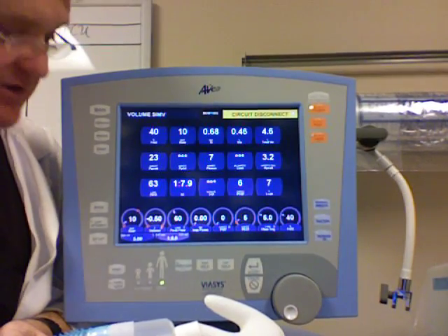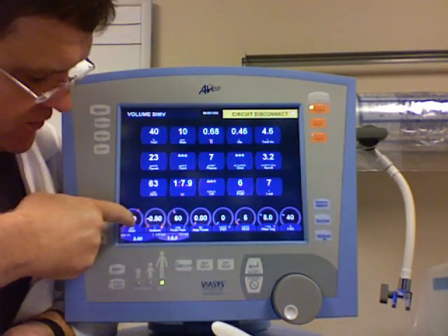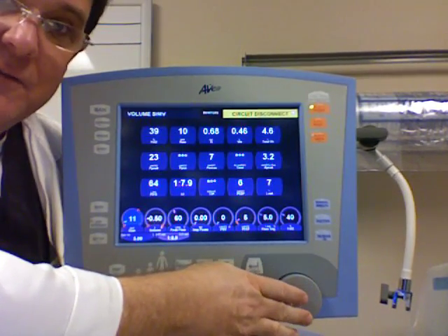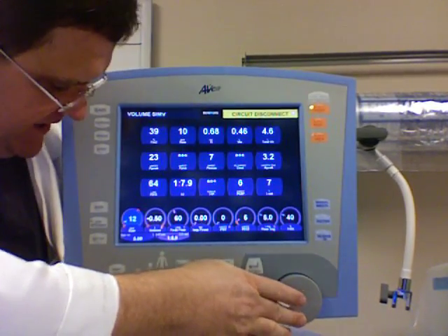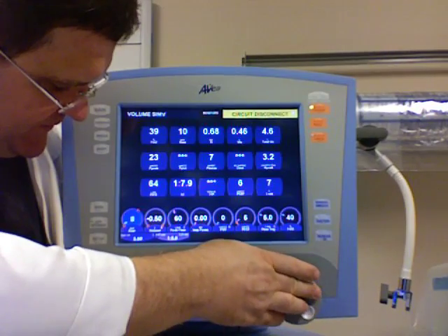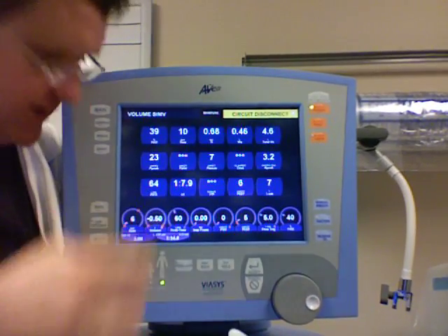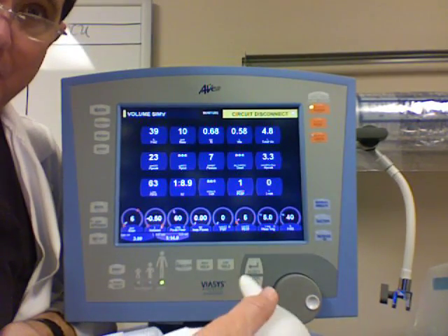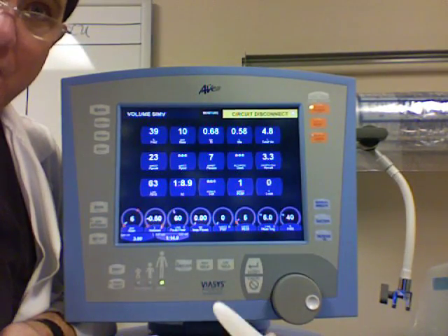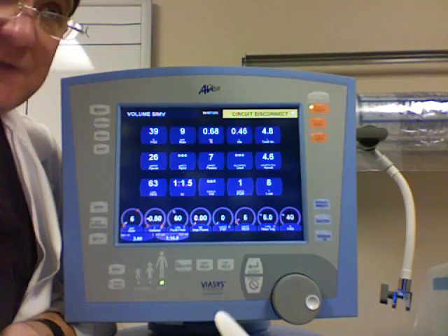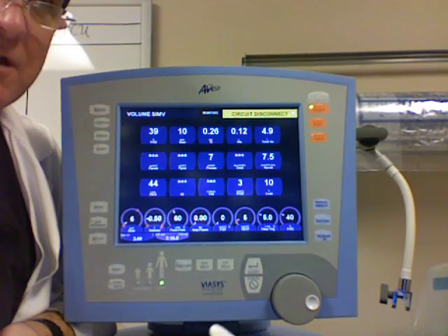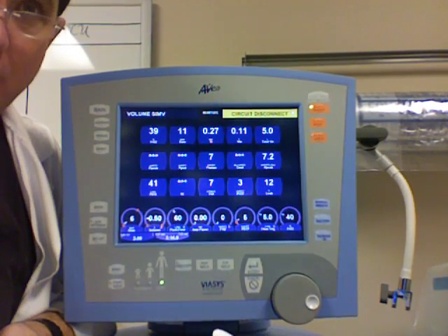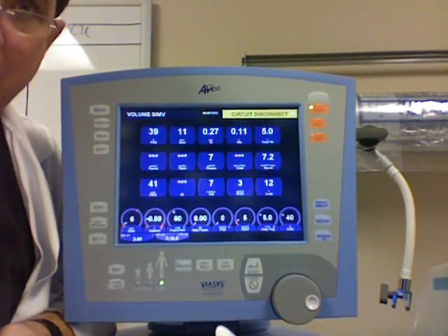But in SIMV you can start turning your rate down — let me turn it down to six — and then you can see if the patient is going to make up the difference in minute volume by breathing on their own. Sometimes we might wean the patient to an SIMV of six or four before we go to CPAP.